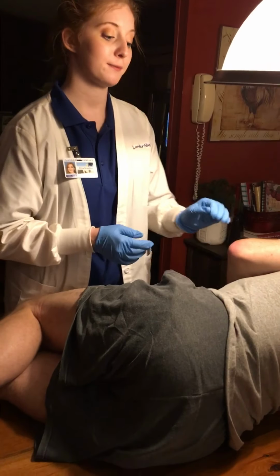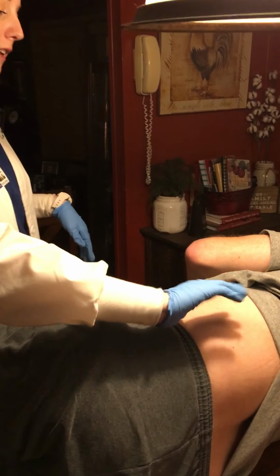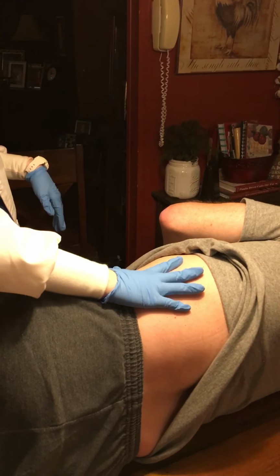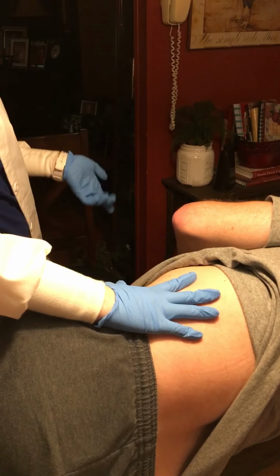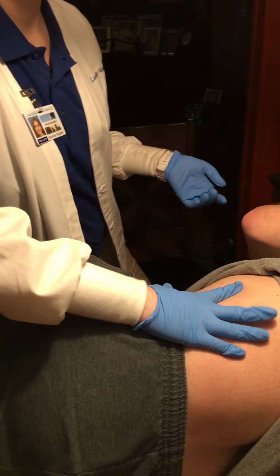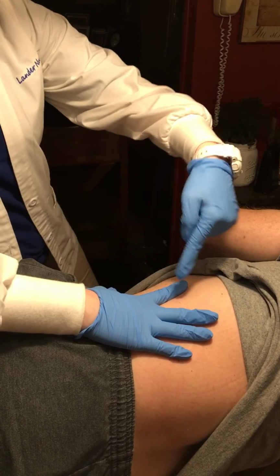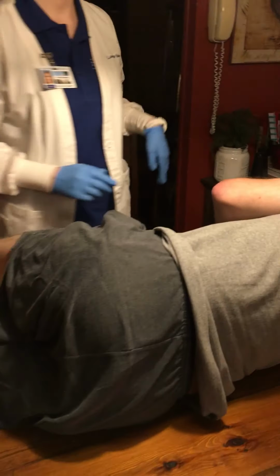And I'm going to do the first site, which is ventrogluteal. So I'm going to place the palm of my hand on the greater trochanter, putting my index finger on the anterior superior iliac spine, and my thumb pointing towards the groin and my fingers pointing towards the head, moving my middle finger back onto the iliac crest, and the injection site is between the triangle.